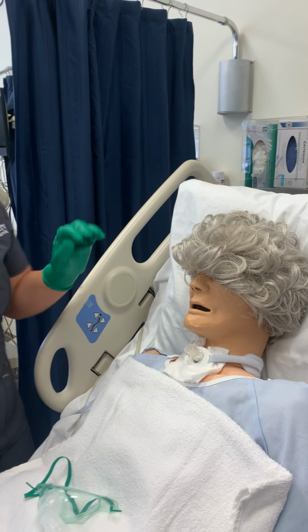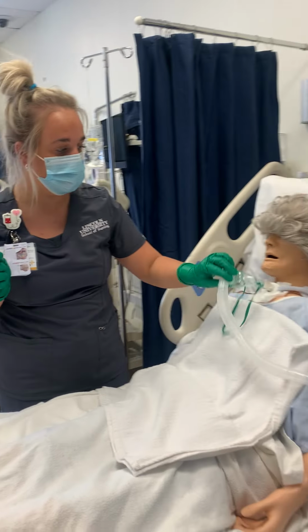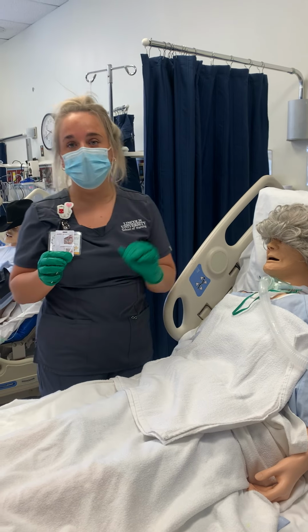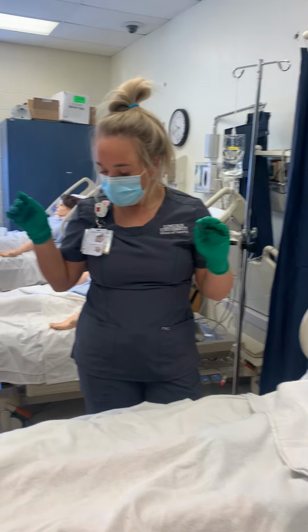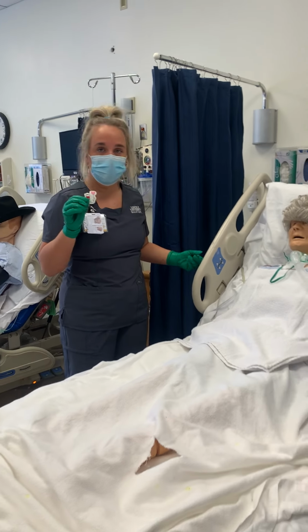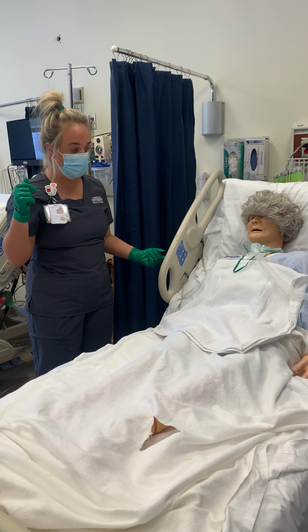Okay, so once I had done everything, make sure I give that oxygen back to her. Make sure she's doing okay. I would probably take a listen to her just to make sure everything went well. I would lower her back down, make sure she didn't need anything, get her call light.